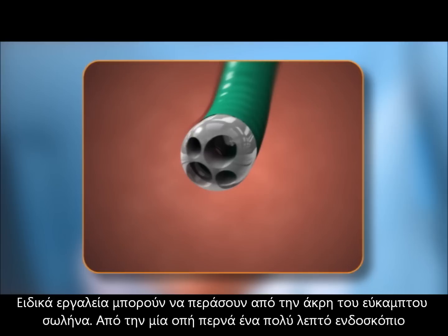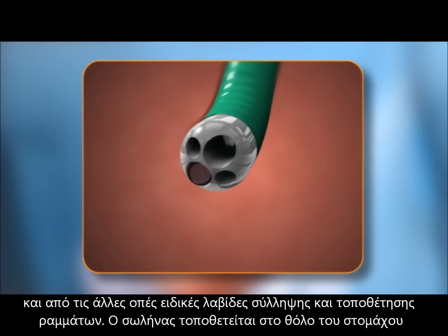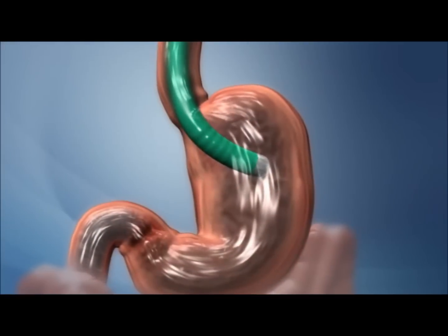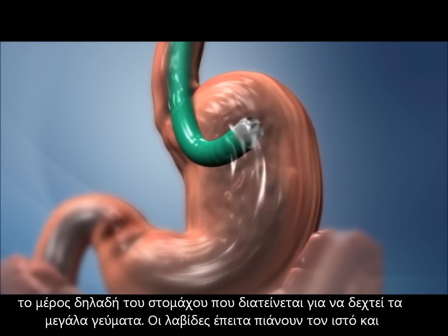Special instruments are passed through the four channels in the tube: a scope to visualize the surgical site, tissue anchors, and instruments to grab tissue and place anchors. The tube is positioned in the fundus, the part of the stomach that expands to accommodate large meals.